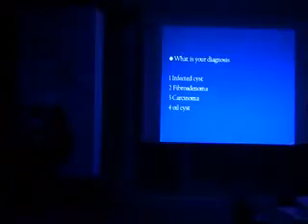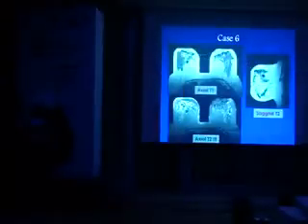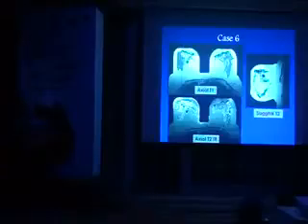Okay. A degenerated fibroadenoma. Why a degenerated fibroadenoma? For God's sake. Let's go back to the images. Usually, fibroadenoma appear what on T1 and T2? High or low signal? Low to isosignal in T1 and probably slightly high signal in the inversion recovery. Unless what? Yes, unless it is calcified. We have seen here, it's very dark signal. The signal is not just hypointense, no, it's dark signal.